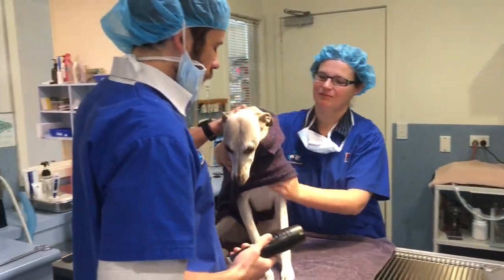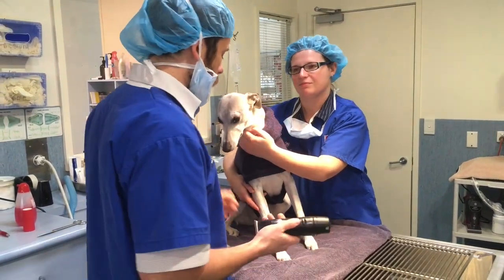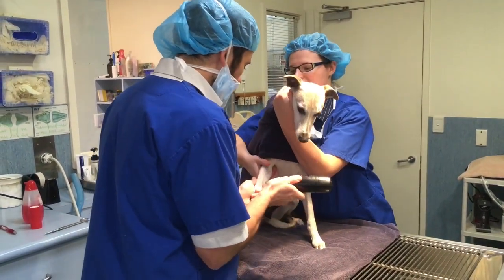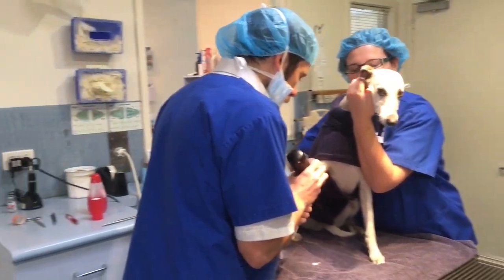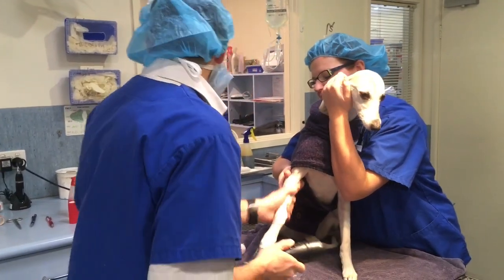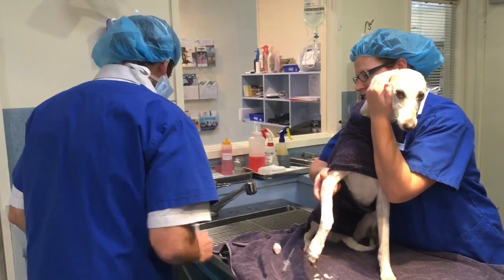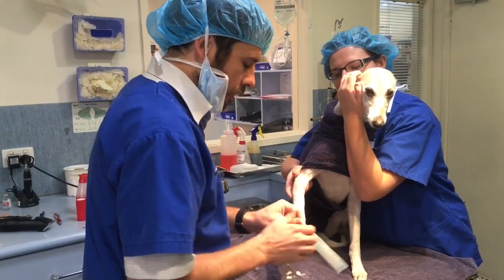Rosie's had her pre-med. Now we're going to give her what's called the induction agent — that's the one that's going to anesthetize her. So what we do is clip a little bit of hair up off the leg so that we can find the vein on the front of the arm. We're going to pop a catheter into that vein in the front of the arm.